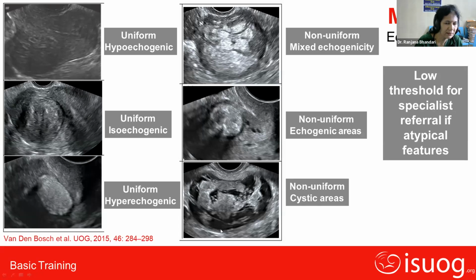And when the supply decreases, degeneration occurs. Hyaline degeneration is the most common. Then it becomes cystic degeneration. It may be myxomatous, lipomatous, or calcific degeneration. There are many types, and last but not least is sarcomatous degeneration. So these are with the cystic area.